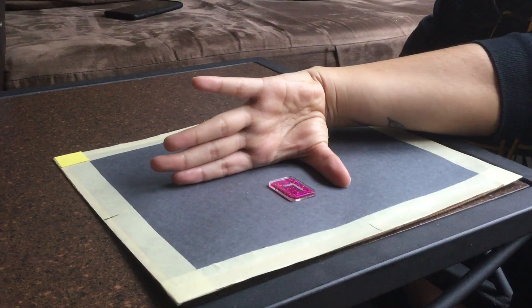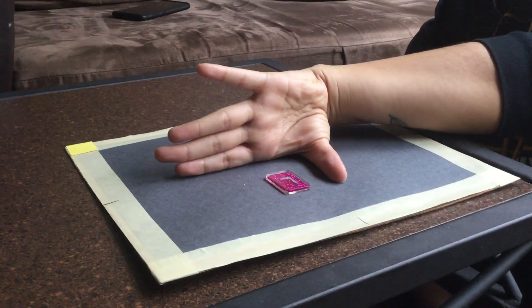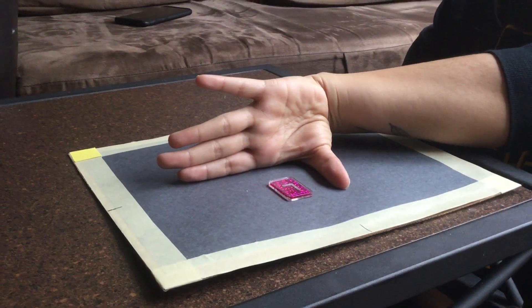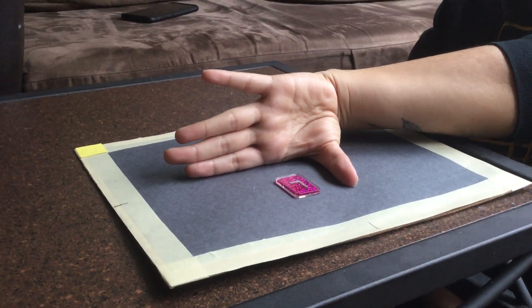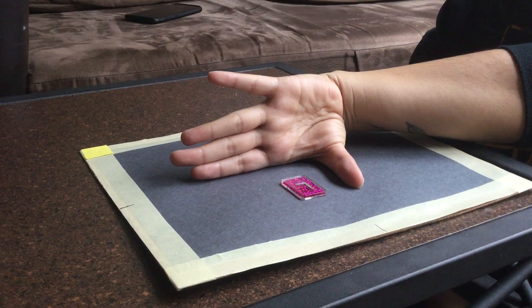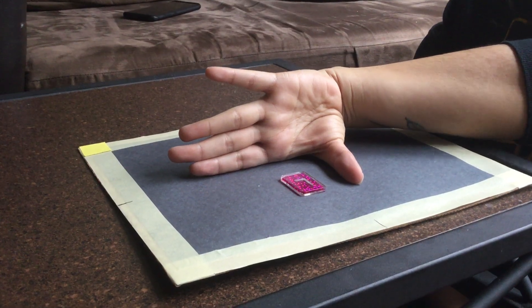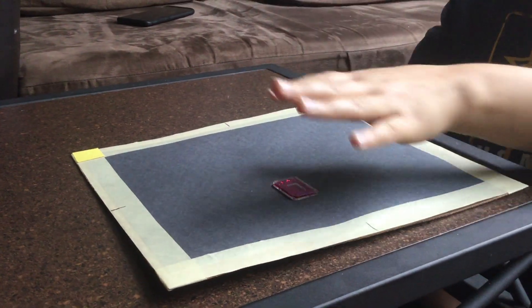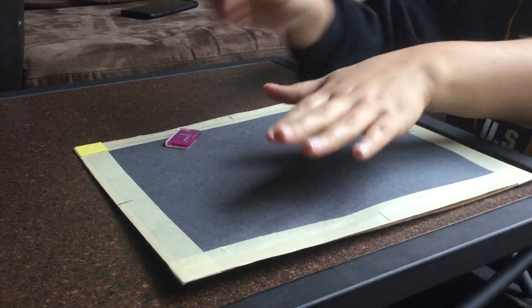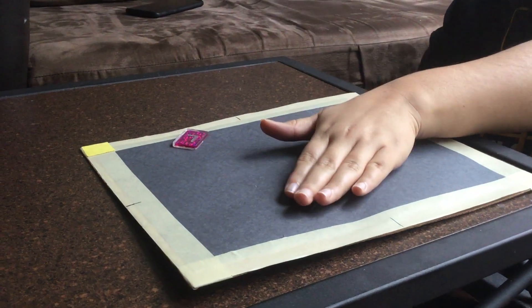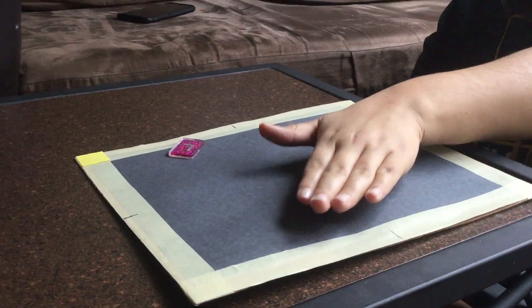The next image that we're going to be doing is the oblique thumb. So what we're going to do is place our hand like this.